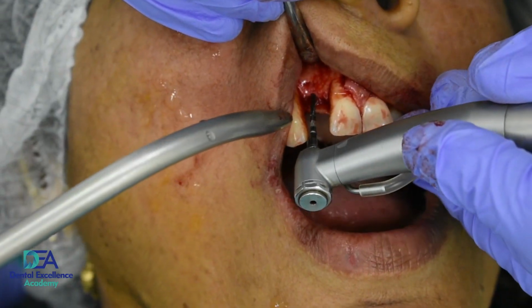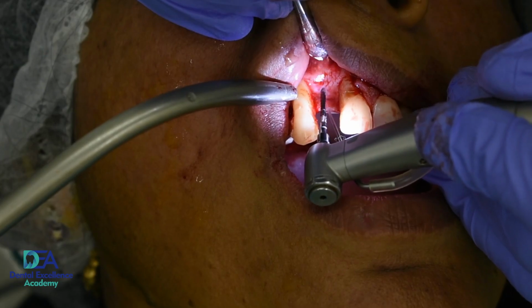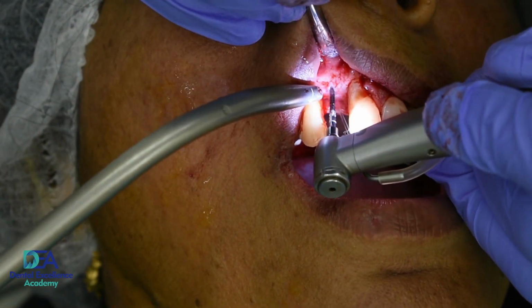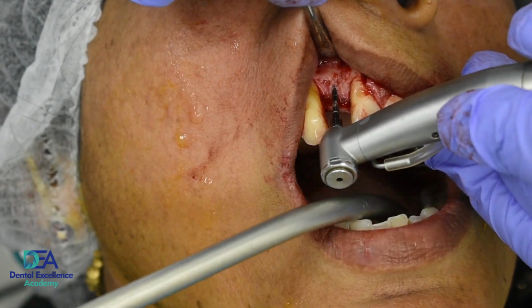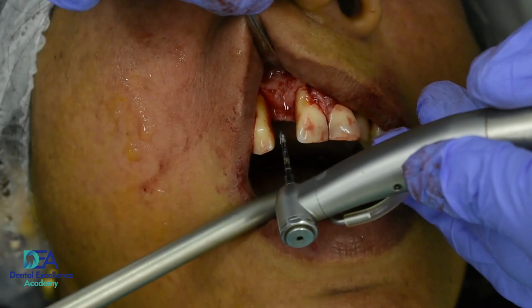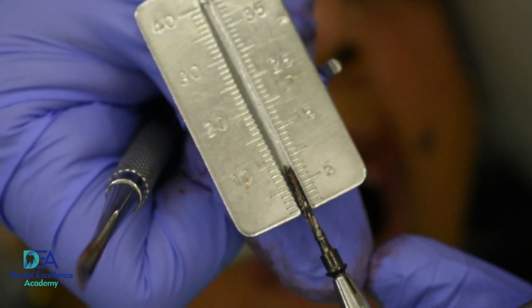So with the lancet drill, I'm starting with the osteotomy. So can you see I'm parallel to both the teeth, that is the central and the canine. You should be. So I'm checking for the length. This is 10 millimeter.